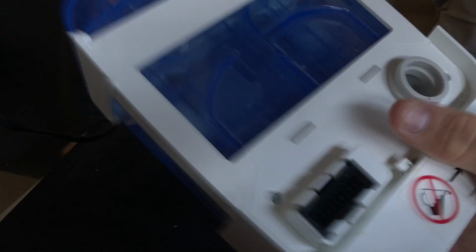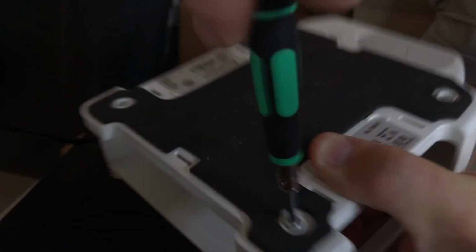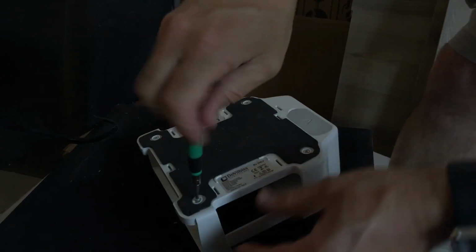So let's start opening this and see where we get. Okay, first the bottom unit here. This contains the water heater. So let's get that out. And you can see this metal plate at the bottom. It's actually still warm because I had it on. This thing heats up and it heats the water. So I'm sure we'll just see some components here for feeding water.